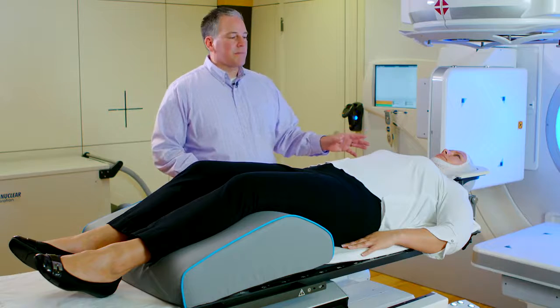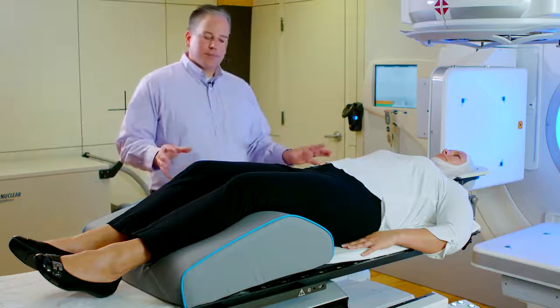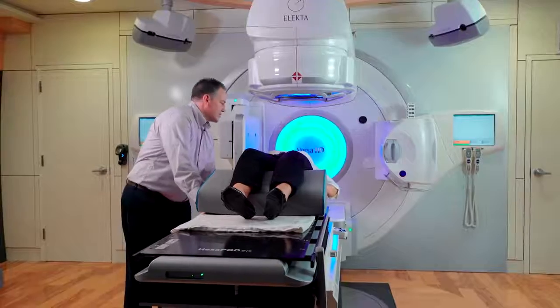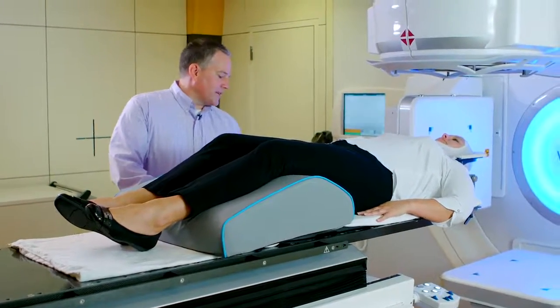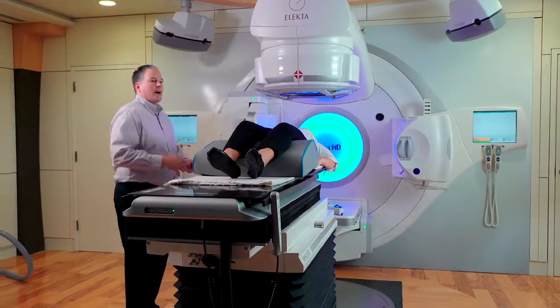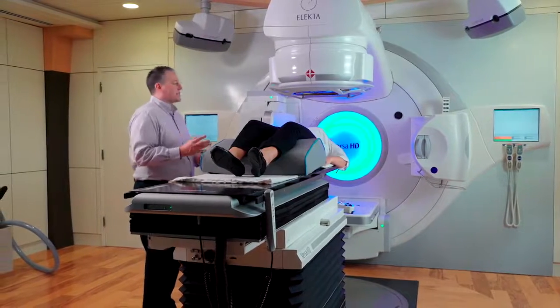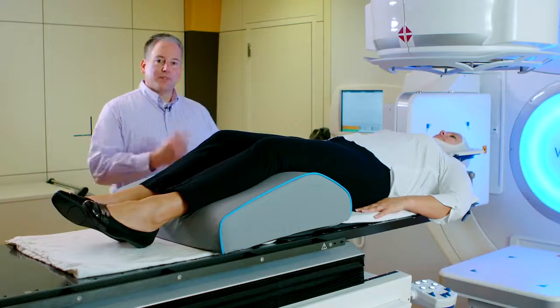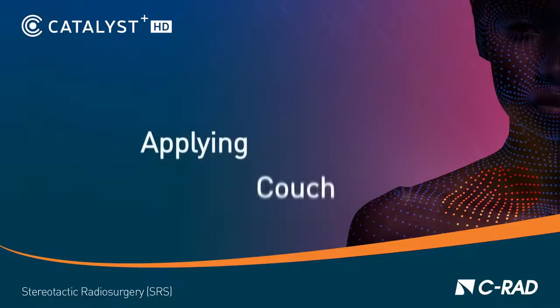You may also notice on the mask there's no marks. What we're going to do is get the patient on the table, get them comfortable, and then just raise the table up and move the table into approximate isocenter. Once we get to roughly isocenter, we're going to let the Catalyst look at the patient, calculate where that isocenter is, and what shifts will need to be made to put the patient precisely in position. So at this point, we'll go to the Catalyst system and send those shifts automatically to the table, which will drive that table into position.